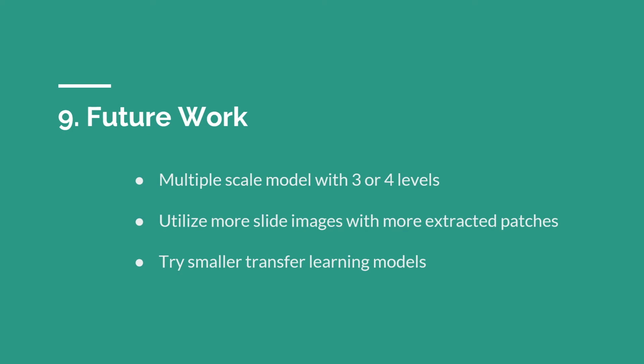Next, since Inception v3 is a relatively large transfer learning model, I expect to train other smaller transfer learning models like MobileNet, which requires less training time.